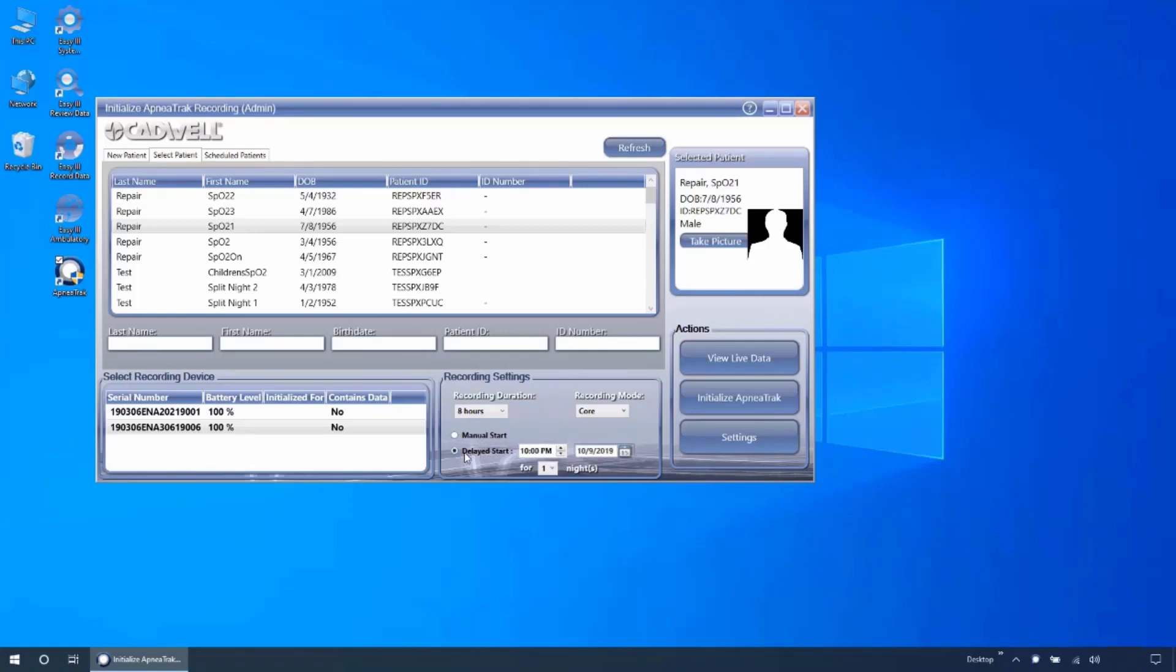Delayed start allows you to configure the time the device will start the recording. In this mode, the device cannot be started by using the button until after the recording has been completed. You can use the arrows or type into the field to set the time to start the recording.